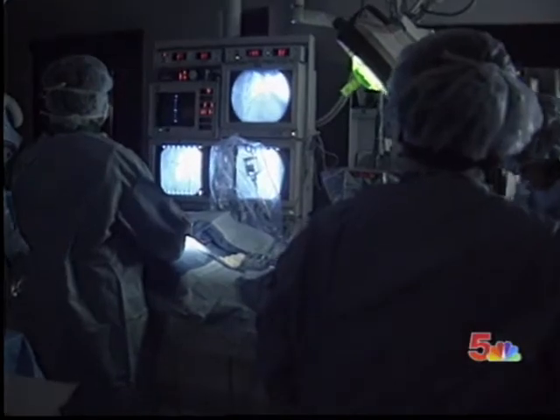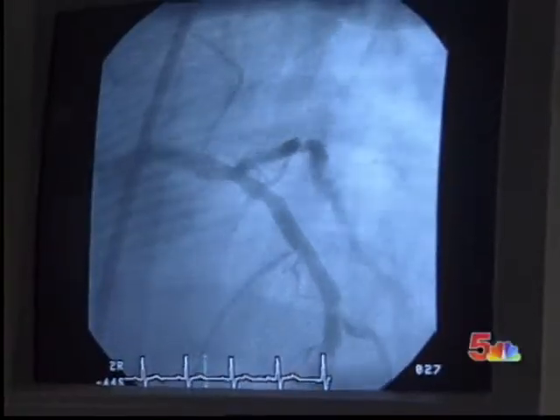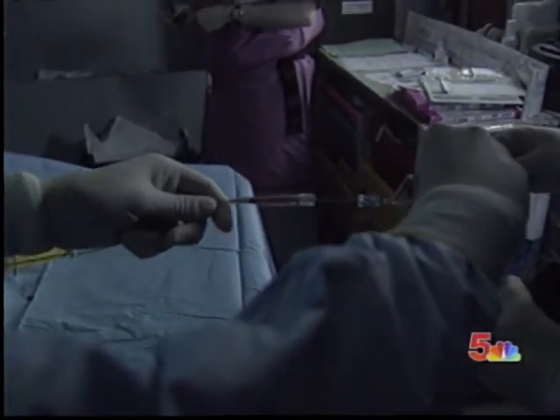The ability of the radial stent to self-expand is something no other stent can do. The old balloon stents had to be inflated, and that took a long time, putting a patient at a higher risk while on the operating table. So this is a much, much quicker and easier deployment, no question. Less work means better results for the patient. Well, we would hope so.